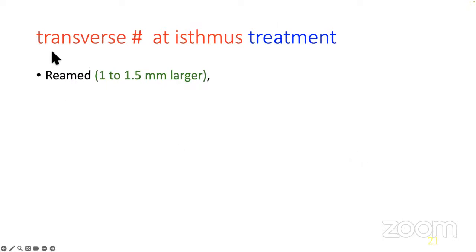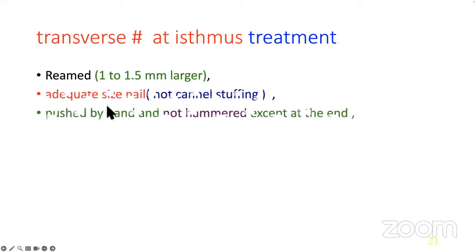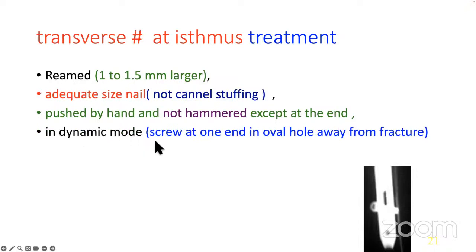So in a nutshell, transverse fracture at the isthmus, I am talking about, please understand, at the isthmus. Isthmus is where the cavity is the smallest, and there the fracture occurs, where the nail hold is highest, 2 inches above and 2 inches below the fracture. When the nail hold is good, that is the isthmus fracture. Treatment is reamed 1 to 1.5 larger, adequate size nail, not a canal stuffing nail, pushed by hand and not hammered, except only at the end. In a dynamic mode, means the screw away from the fracture in that oval hole. That is the one which is in a dynamic mode. Full weight bearing on day one.